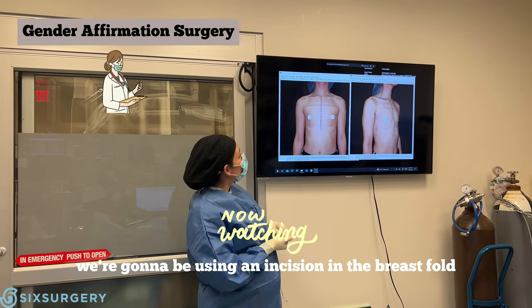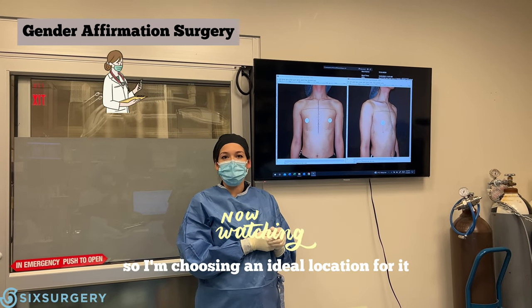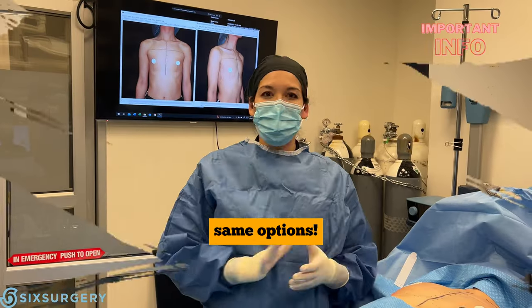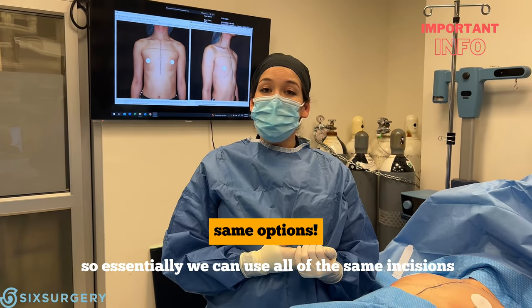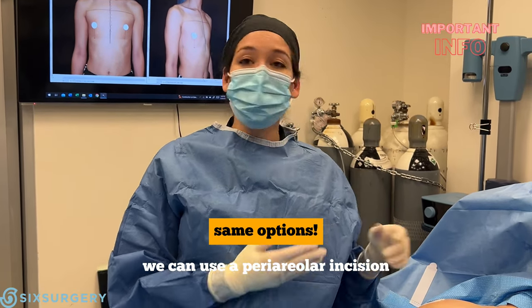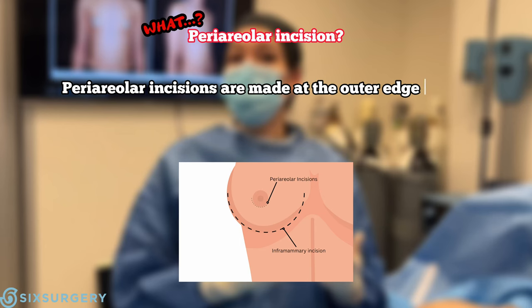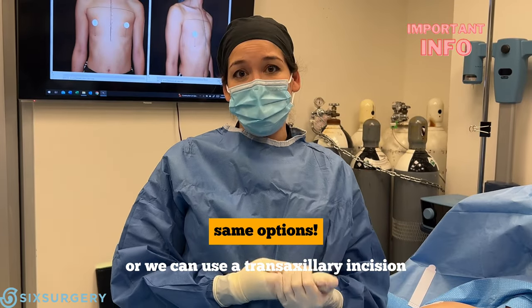We're going to be using an incision in the breast fold, which is somewhat ill-defined, so I'm choosing an ideal location for it. For gender-affirming top surgery, patients have the same options — we can use all of the same incisions. We can go in through the breast fold, we can use an areolar incision, or we can use a transaxillary incision.